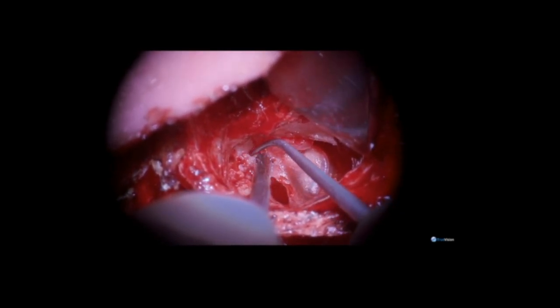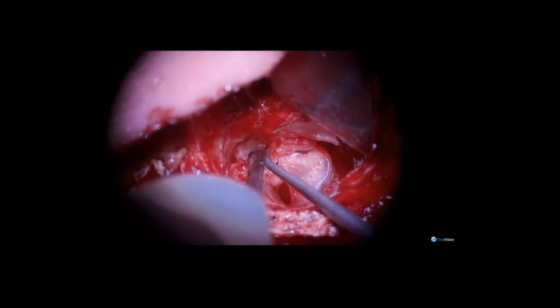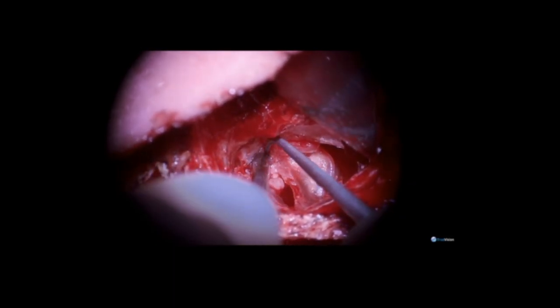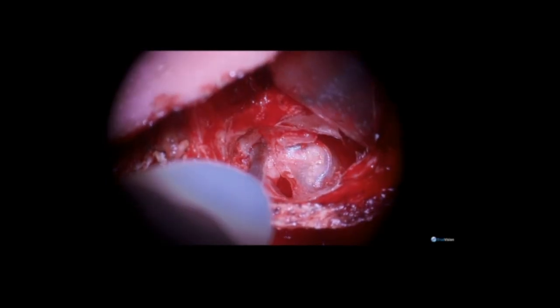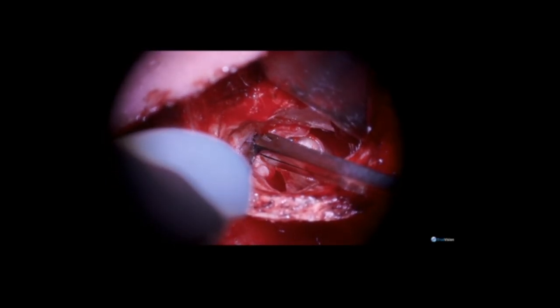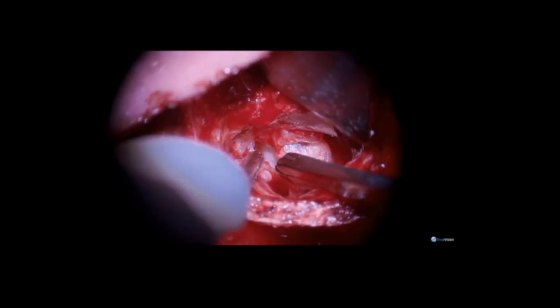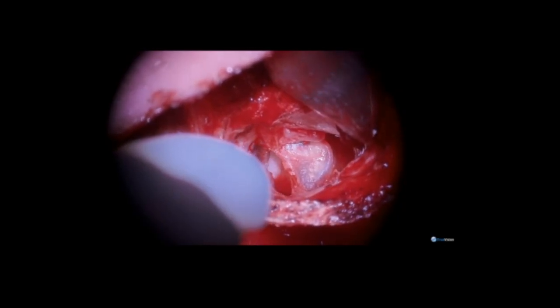And now you can see, using a gentle curved Rosen needle, that I am dissecting the anterior superior aspect of the annular ligament and separating it cleanly so that everything inferiorly will remain during the reconstruction, and then everything superior to this region will be completely excised and removed.